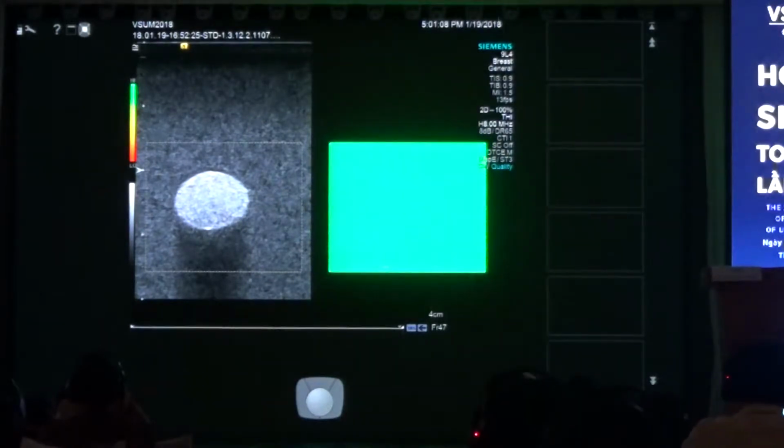And then we also have the quality map. This is like a traffic light. Green is go, yellow is caution, red is stop. So this is telling me, because it's nice and uniform green, that the shear waves were very good. They were very strong, the displacement was very good, they traveled through things the way we would expect, and we can believe that those are good shear waves.